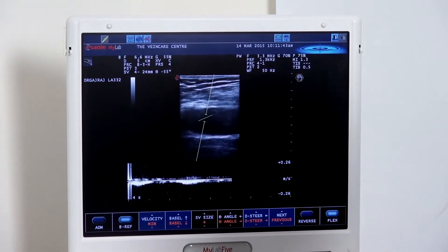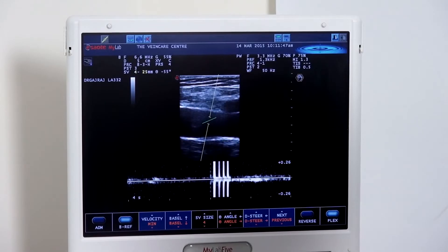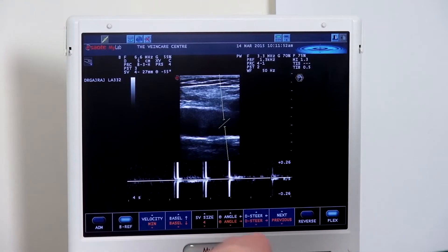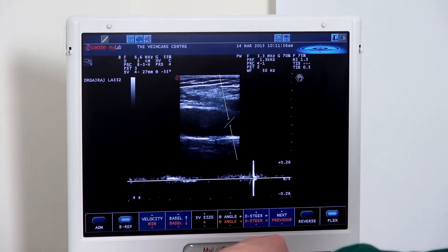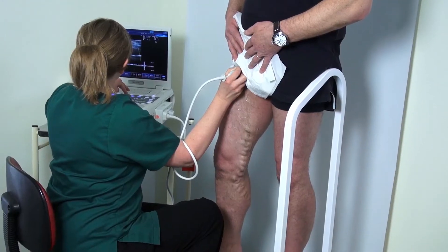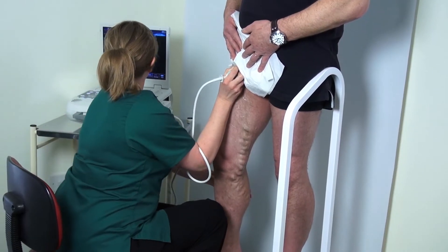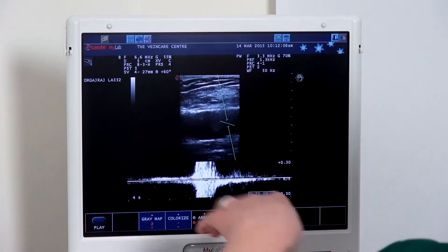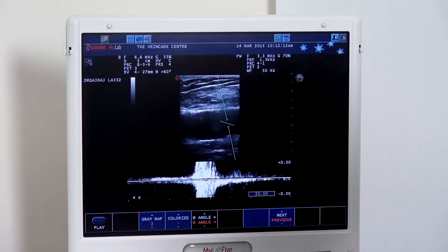Moving further down the vein, we can see that our angle has changed, and we need to appropriately change that angle to meet the vessel walls by manipulating the machine controls. Again, performing squeeze and release — we can see good forward flow and complete cessation of flow, demonstrating a nice, deep, competent system.